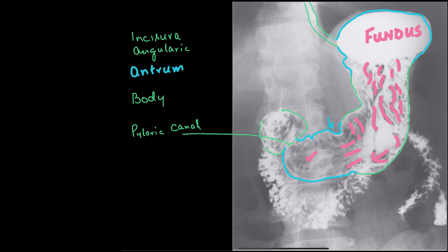After that, this area is known as duodenal cap. This is my duodenal cap. It is also known as first part of my duodenum or the superior part of the duodenum.